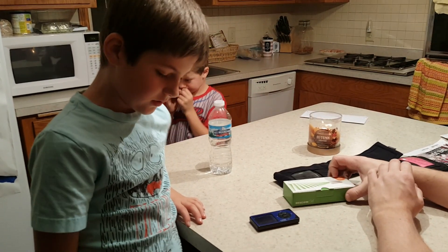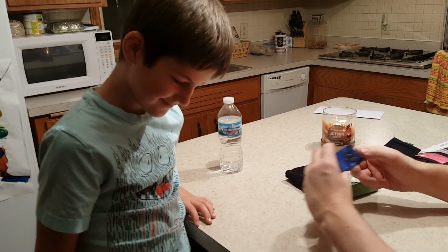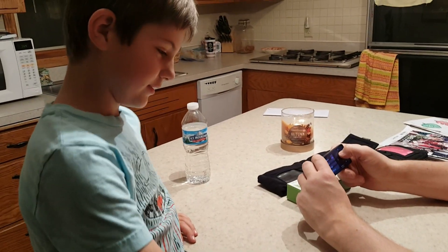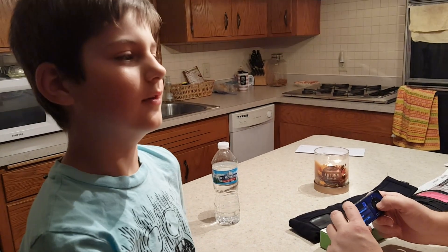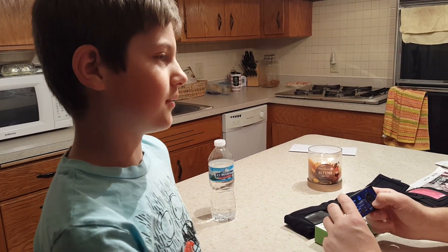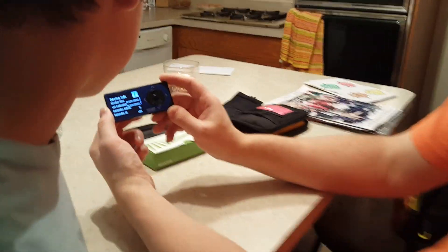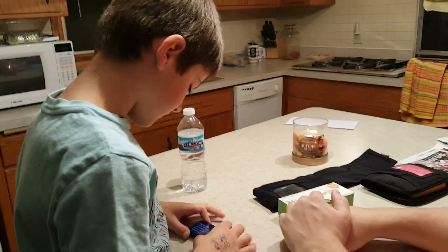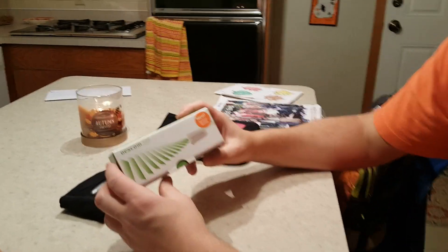What happened at school today? My transmitter is busted. Your transmitter busted? What did your Dexcom say? It said the transmitter battery is dead. Did it say transmitter failed? It said transmitter failed. Here it says the transmitter battery is okay. So it had been saying the transmitter battery is fine, but today at school it said transmitter failed, so we needed a new transmitter — that's what we're gonna do today.